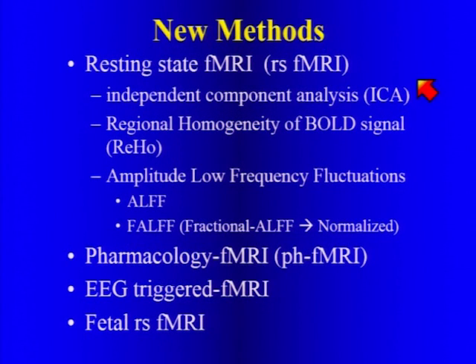As alluded to a little bit through the talk, there's resting state, and there's been a lot written about this. When we first started doing fMRI, we would see a couple of articles a week. Last week I looked on PubMed, and there were over 100 articles on fMRI published that week. And it's been that way for quite some time. So it is exploding, and it's in the hands of many people, psychologists and psychiatrists, and some of this is using these components.